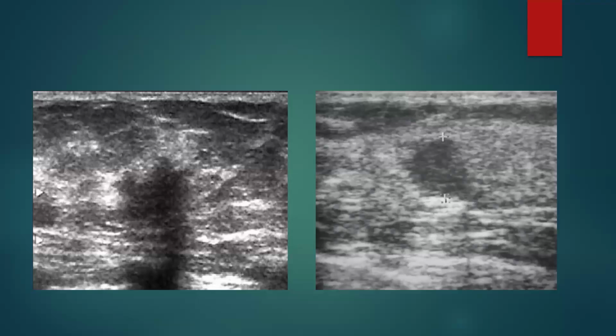Here you can see a hypoechoic mass with irregular margins and posterior acoustic shadowing in the first image. And in the second image, the patient presented with a circumscribed hypoechoic mass with posterior acoustic enhancement. So it's a range of appearances.